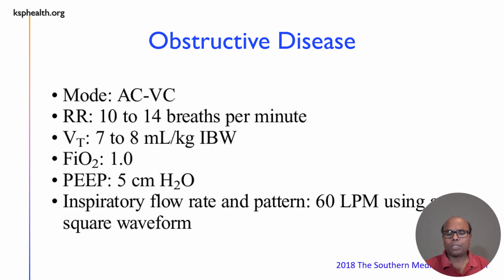I typically do 6 to 10 centimeters of water to combat the auto-PEEP. So you need to apply a certain PEEP so that you offset the auto-PEEP.